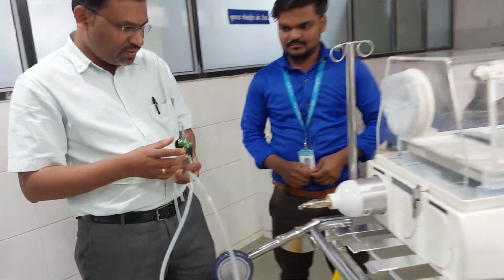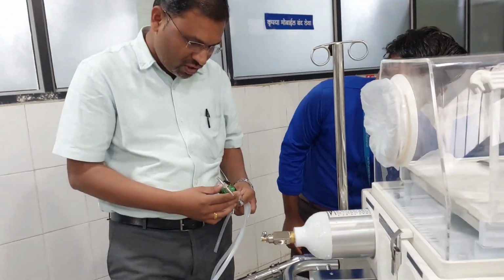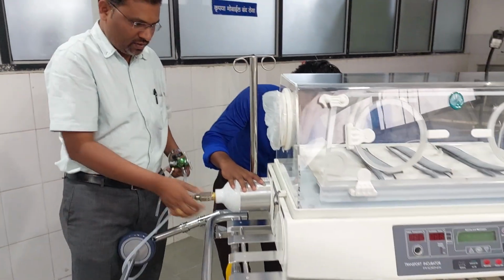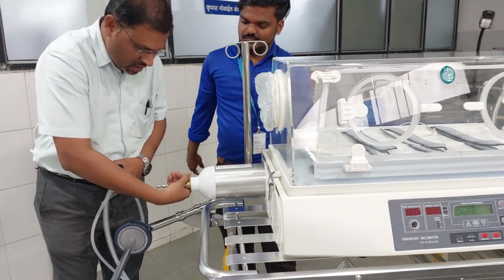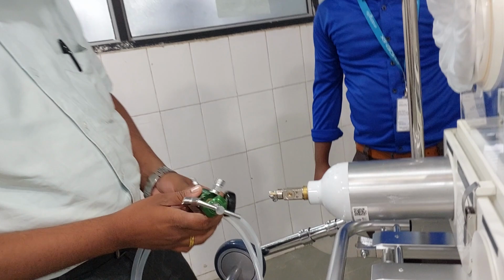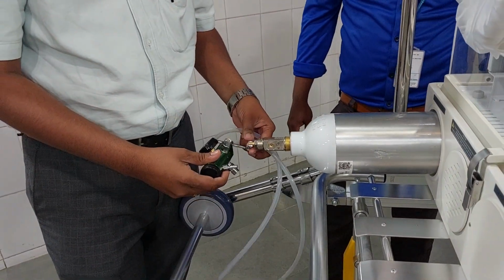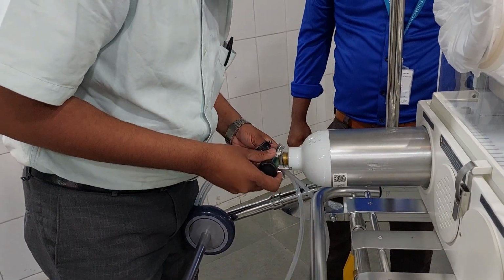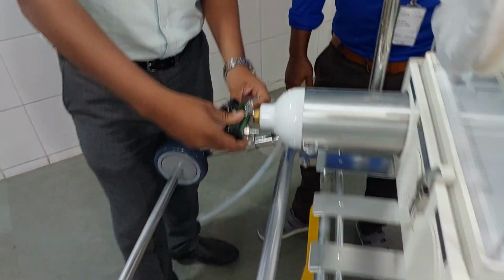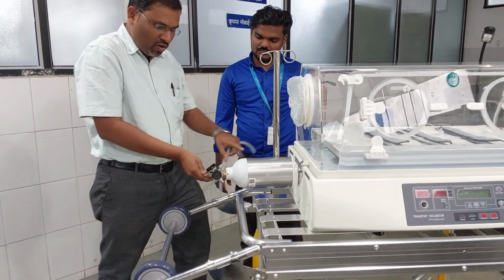Now how to fix this regulator? Come close. See, this is the knob to switch the cylinder on and off, that means to release the oxygen or stop the oxygen. How to fix it? You can observe, for the cylinder also you can make it lock. At the bottom side they are giving the cylinder lock mechanism. You can observe these two knobs, and for this also they have given these two knobs. These two probes should be inserted in this hole. So just insert it like this and fix it. After that, tighten it properly. Once it is tight, with the help of this you can open or close the cylinder.